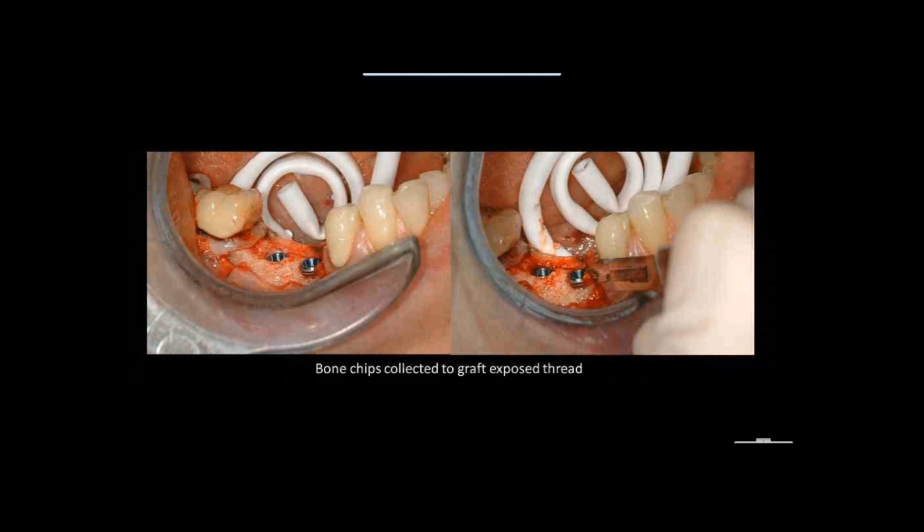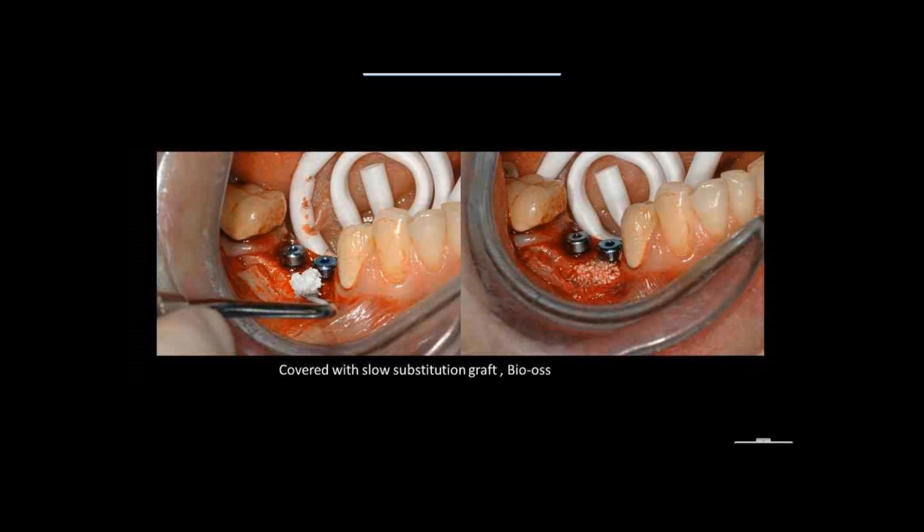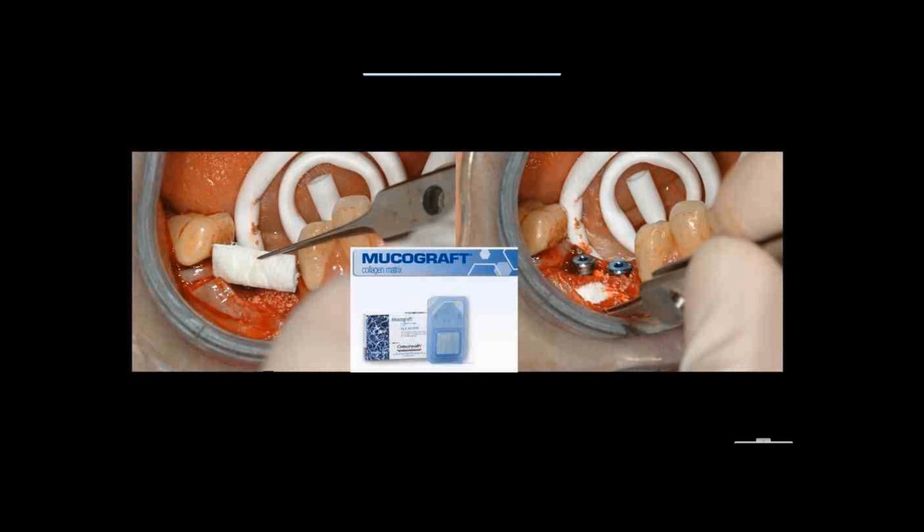The implants have been placed and we have a little bit of exposure on the buccal of our first implant. We use a small scalpel to graft a little bit of the bone we have on one side. We now have a little of the patient's own bone on the buccal. Then we add some non-resorbable or very low-resorbable material — in this case bio-oss — to protect that site. From Osseo Health, instead of going to the palate for connective tissue, I use mucograft from the box and place it on the buccal.